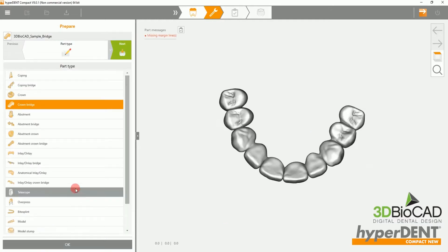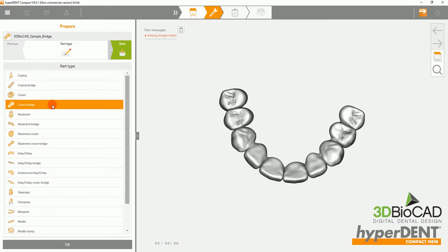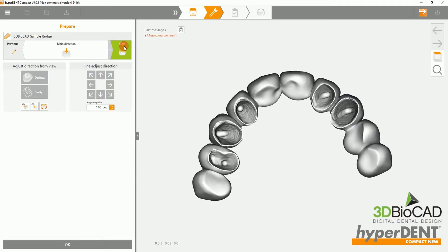Please ensure that you have selected the right part type. Next, you will be setting the milling direction.